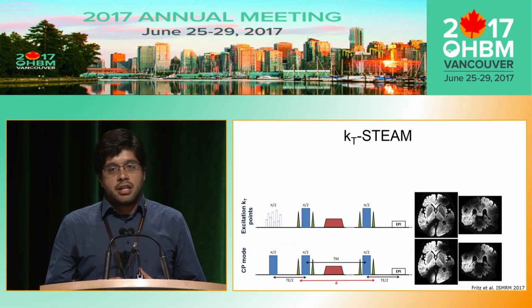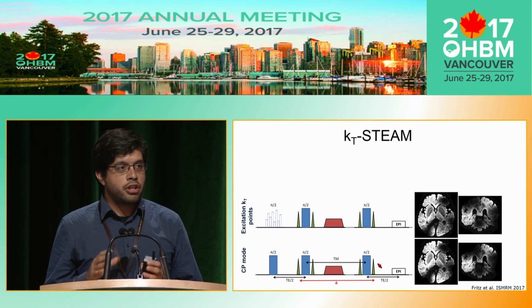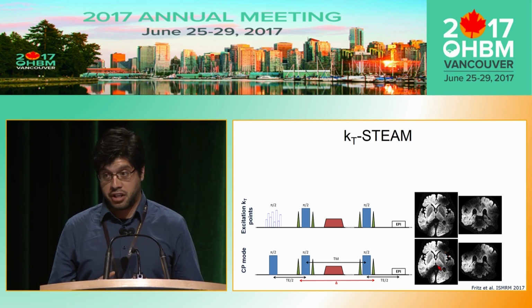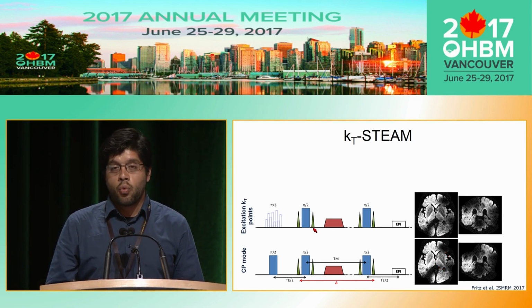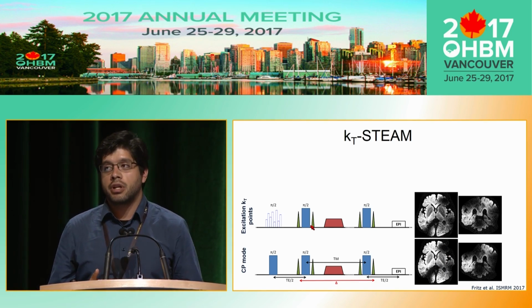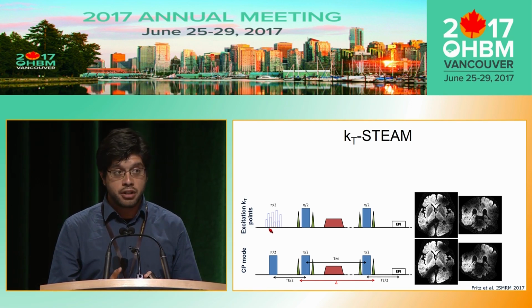So the STEAM sequence, as I said before, is composed of 3 pulses. And using this sequence with the global, normal pulses at 9.4 Tesla shows these inhomogeneities, as I showed before for the GRE sequence. One idea and one approach that we can think about is: why don't we incorporate this set of subpulses in the excitation pulse? Should be enough?